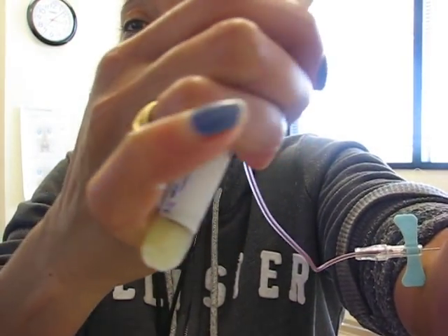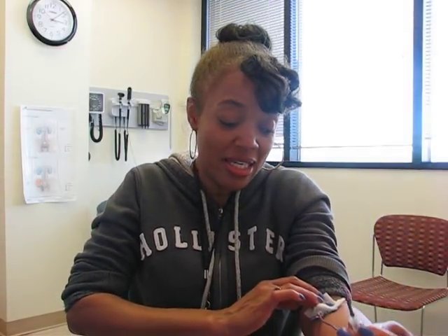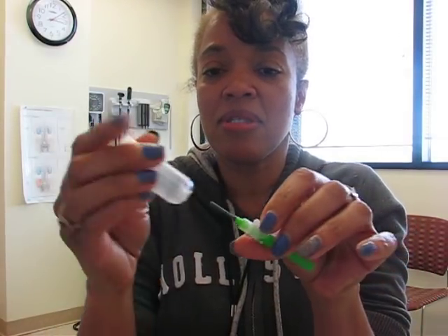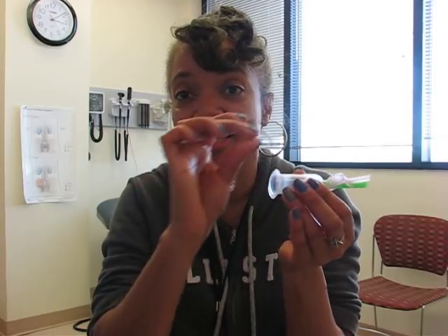So you guys have got to stop depending on these butterflies. Now I'm not a hard stick, so I stuck myself and I get my blood filling up the tube — see that? We're getting blood. That's not going to always happen. You cannot always depend on butterflies, and I don't know how else to say that to you guys. The tubing — that's key. When you stick the patient with a straight needle, do you know what happens? This is the end where the sheath is pushed up once you put the tube in. What happens? It goes straight into the tube. There's no interference. Your butterfly — that tubing is interference when you have a difficult stick.